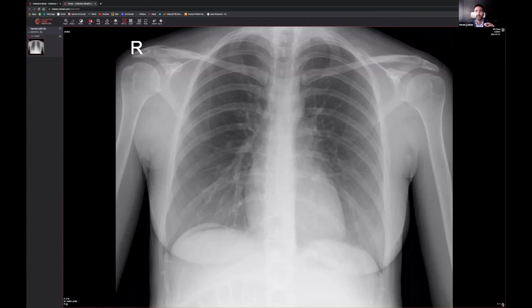clavicles. Genuinely, I had one case where it was bilateral. Someone was walking along and they fell down a manhole, and they didn't fall right in because they tried to stop themselves, and both shoulders got dislocated. When they went into x-ray, they were a bit inebriated. They were drunk, unfortunately, so they couldn't really tell you where the pain was. When they did the x-rays, because the humeral heads looked symmetrical, no one picked up on the fact that they had bilateral dislocated shoulders. Quite unfortunate. So it is quite important to be aware that there's more anatomy than just the lungs.